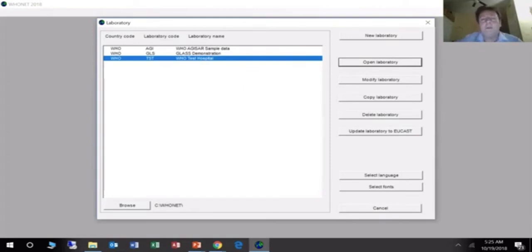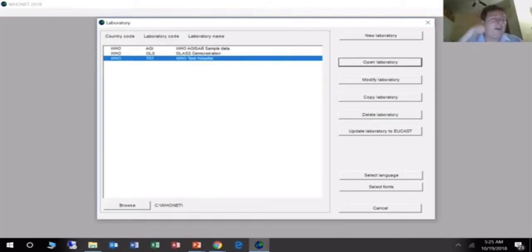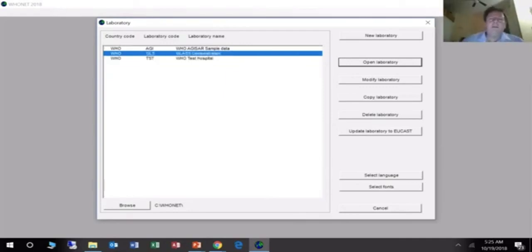We have these nice tutorials where you can actually teach yourself the software. Everything I'm doing in the presentation today, you can also do yourself afterwards using the tutorials, and I will show you where the tutorials are. This one here called GLASS is almost the same. We're going to combine those two together. The only difference is that these are old human data without age, gender, and date of admission, and it follows our tutorials. This other one, we don't have tutorials highlighting the analytical capabilities, but this file does have age, gender, and date of admission, so it makes a more interesting example for teaching GLASS, but we're going to merge those two together. We don't need 2 different human examples.